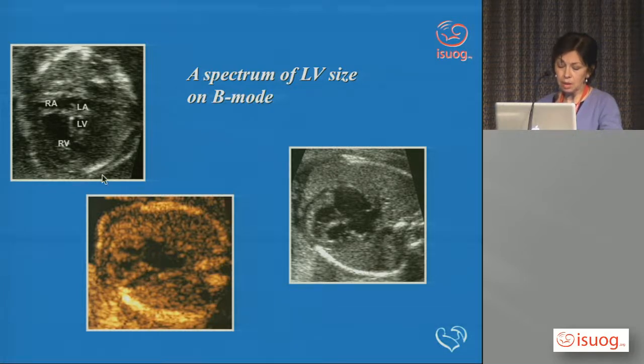So it's not quite the classical short left ventricle, but it could still end up having a Norwood procedure. And another type is when you have a very thick wall ventricle with signs of brightness, usually reflecting endocardial fibroelastosis.